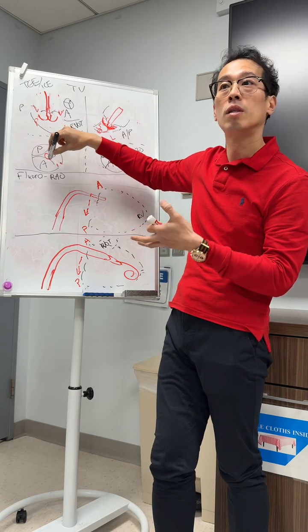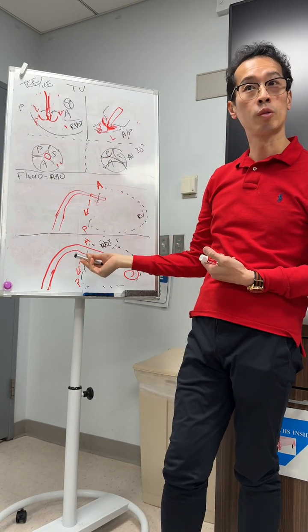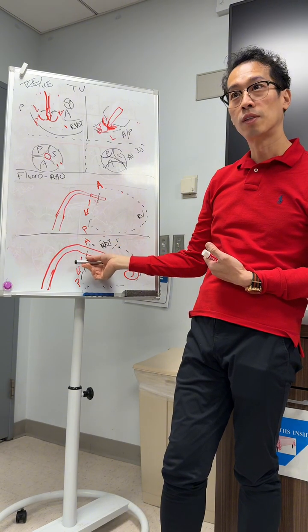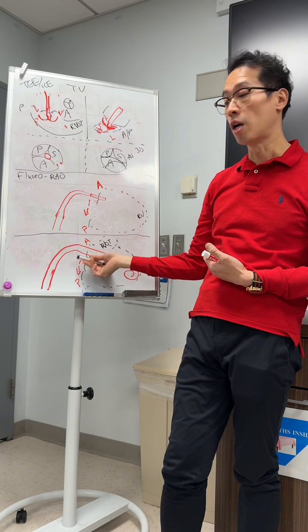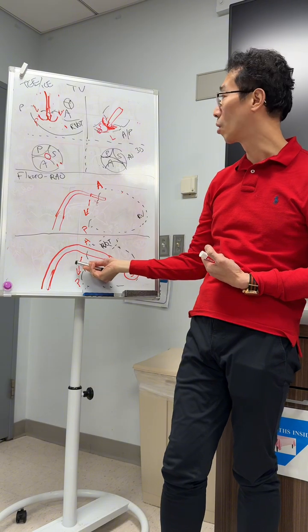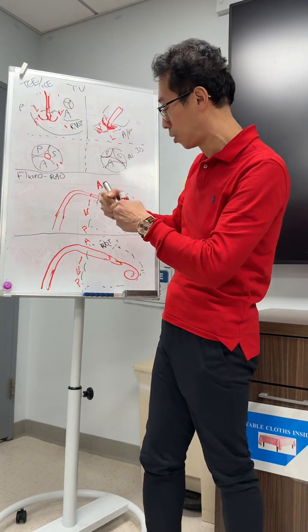If not, you're caught in something. And you should be able to tell on your fluoroscopy as well, because what you see is like this, it's dragging, because this is pulling back. It should look like this. That means something's caught. If it's not caught, it should be going this way, perpendicular, okay? So now you're here, and you have your anchors exposed.